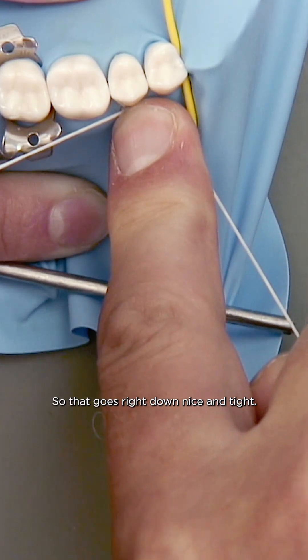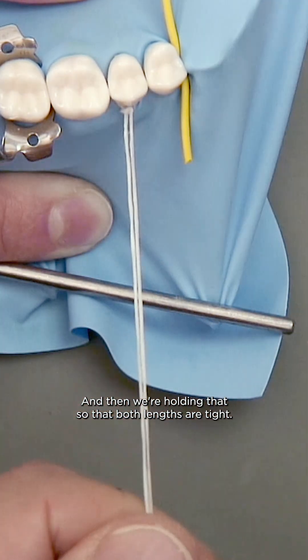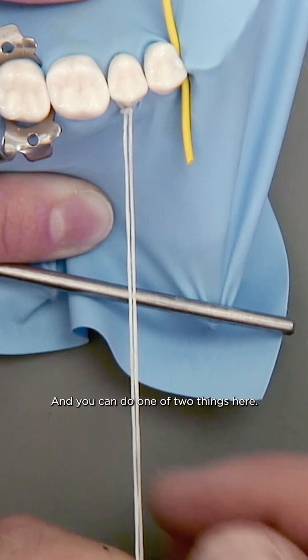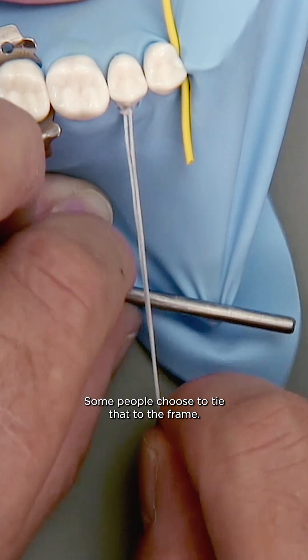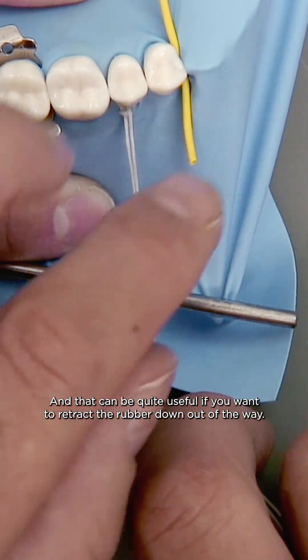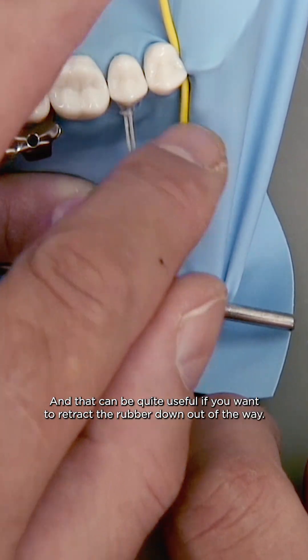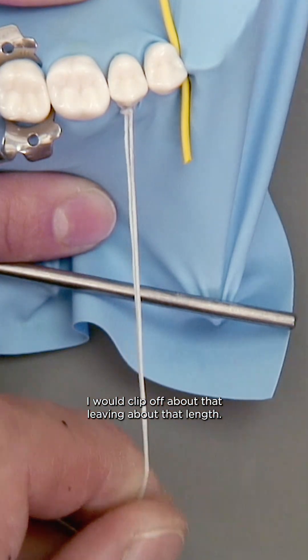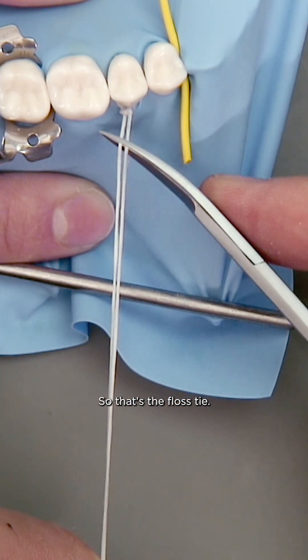So that goes right down nice and tight, and then we're holding that so that both lengths are tight. You can do one of two things here — some people choose to tie that to the frame, which can be quite useful if you want to retract the rubber dam out of the way. I would clip off about that length. So that's the floss tie.